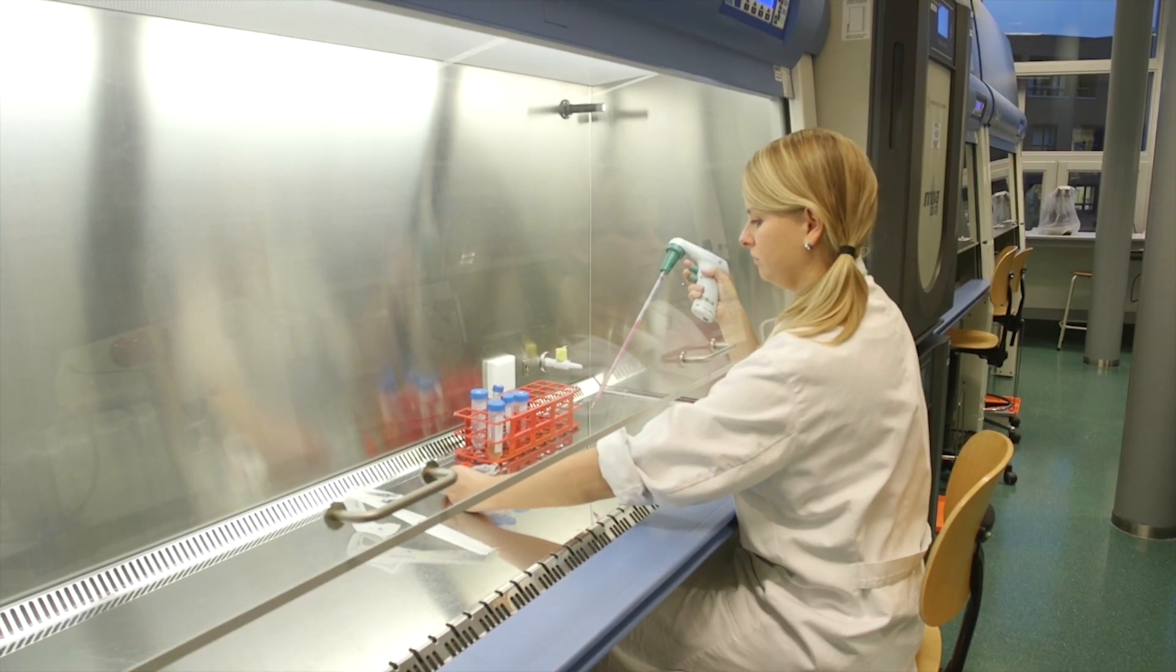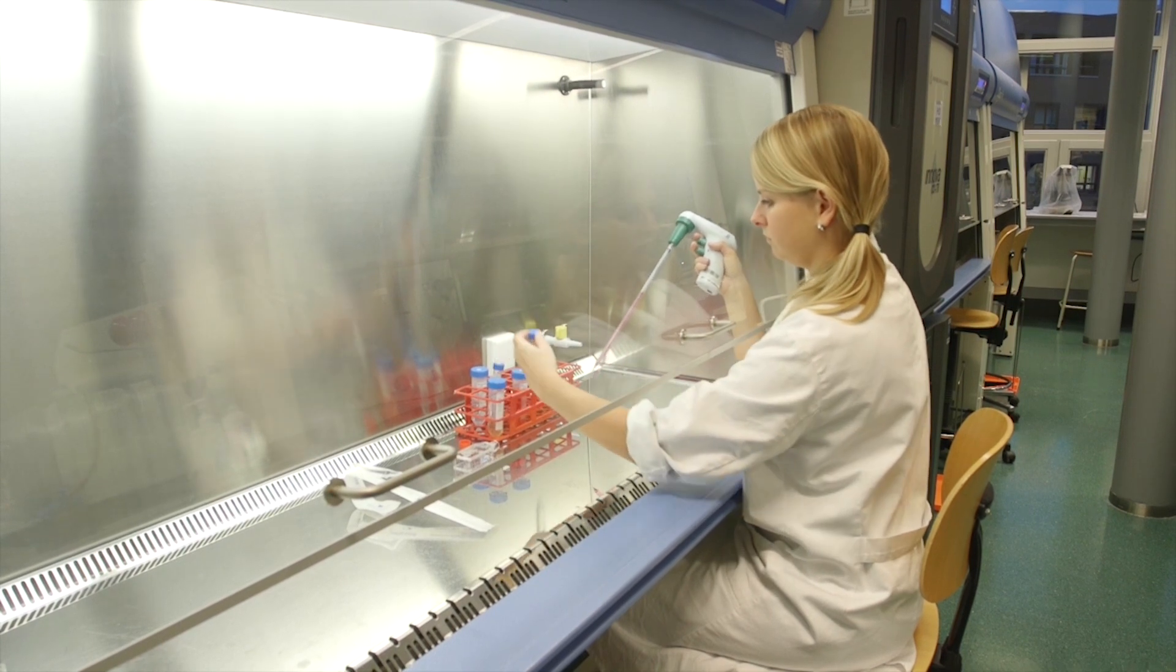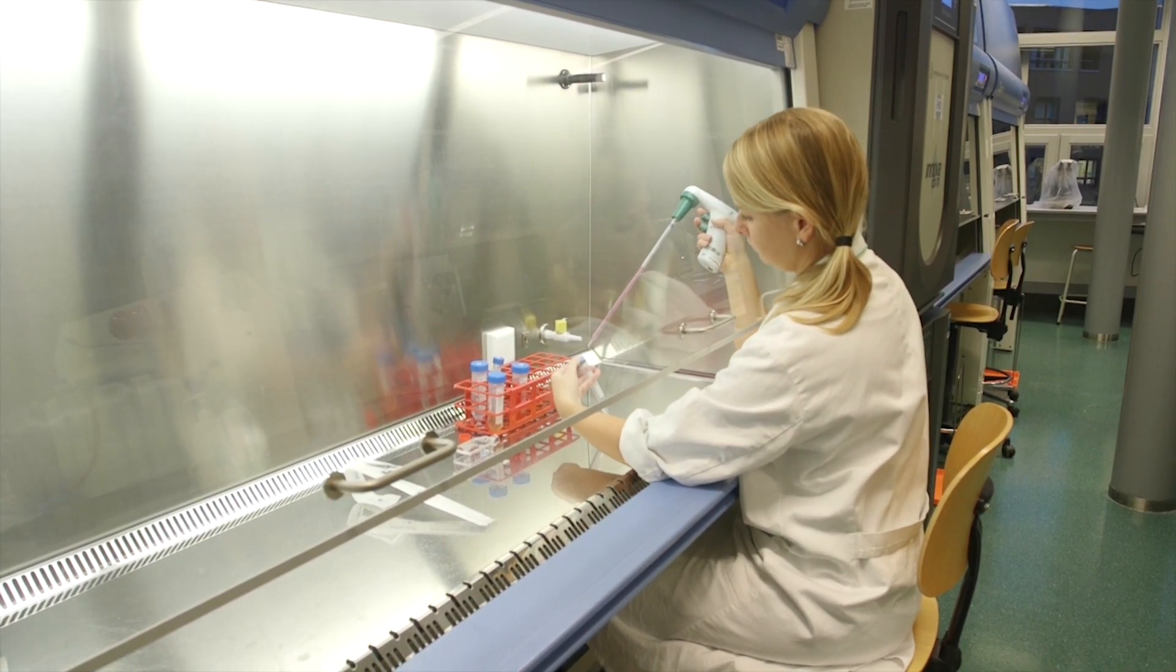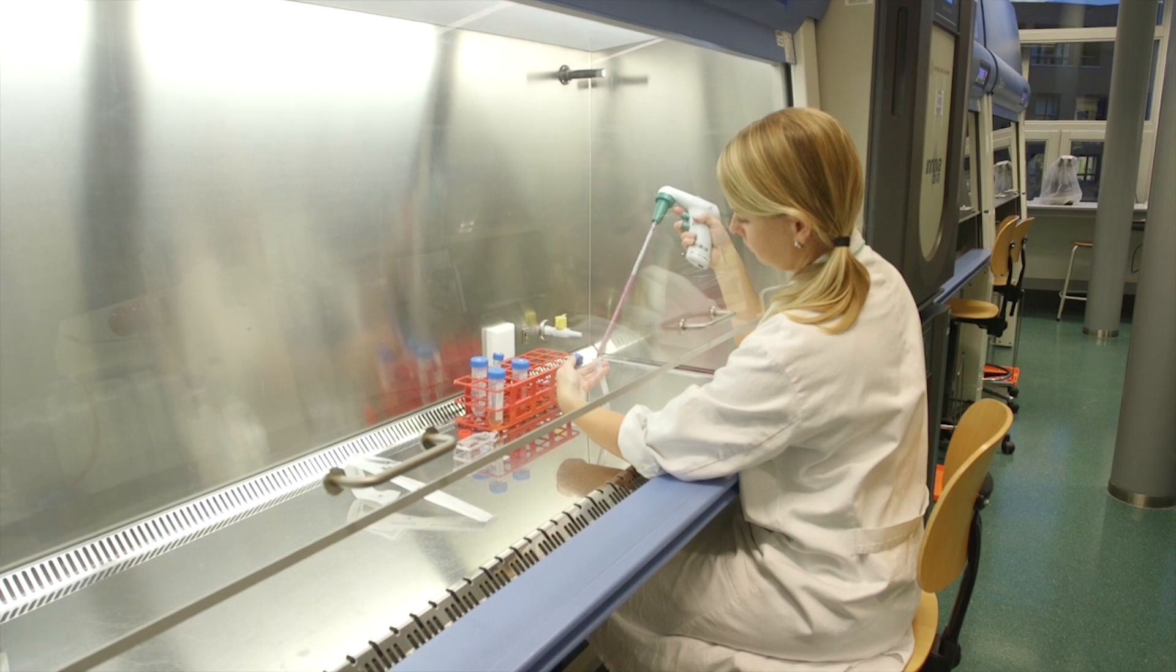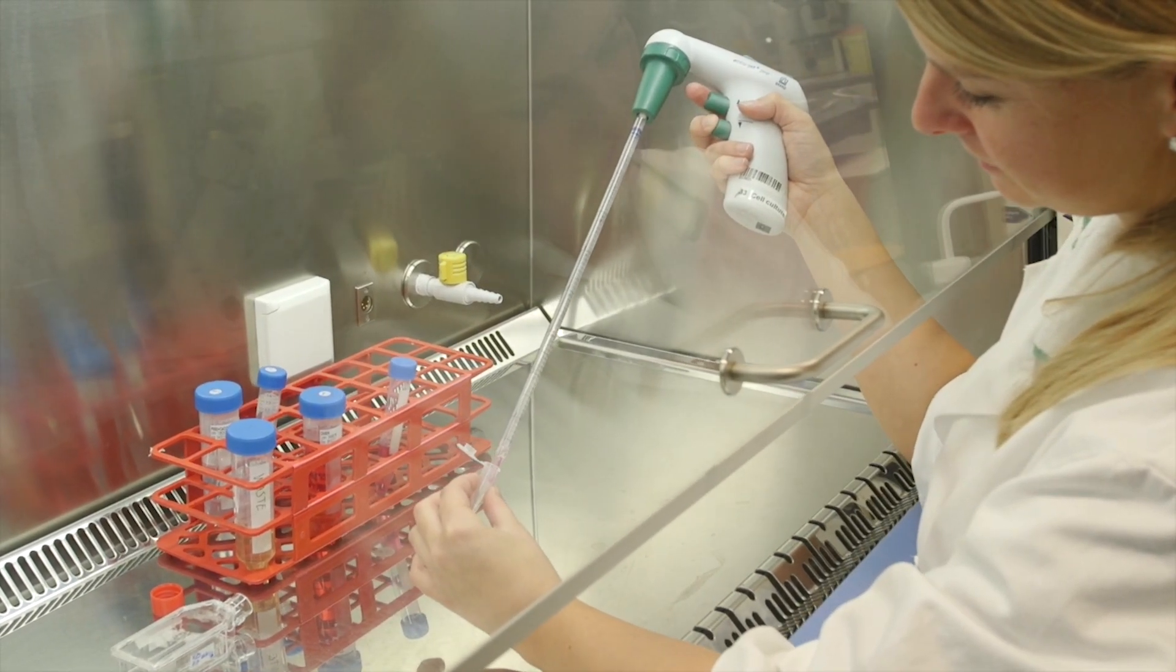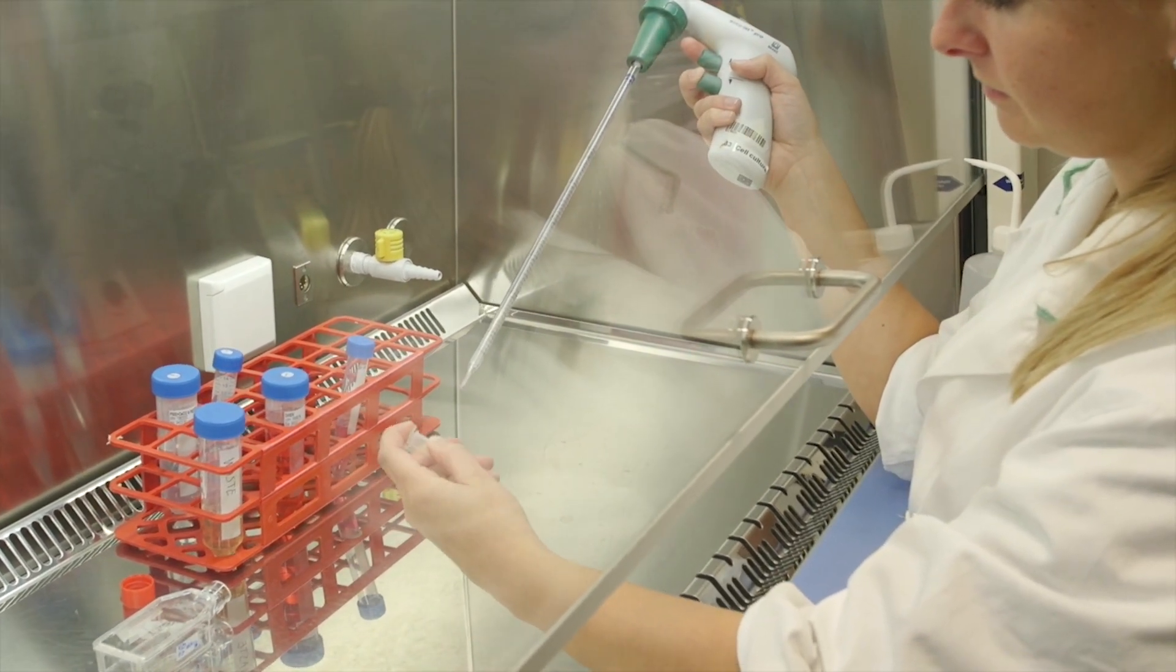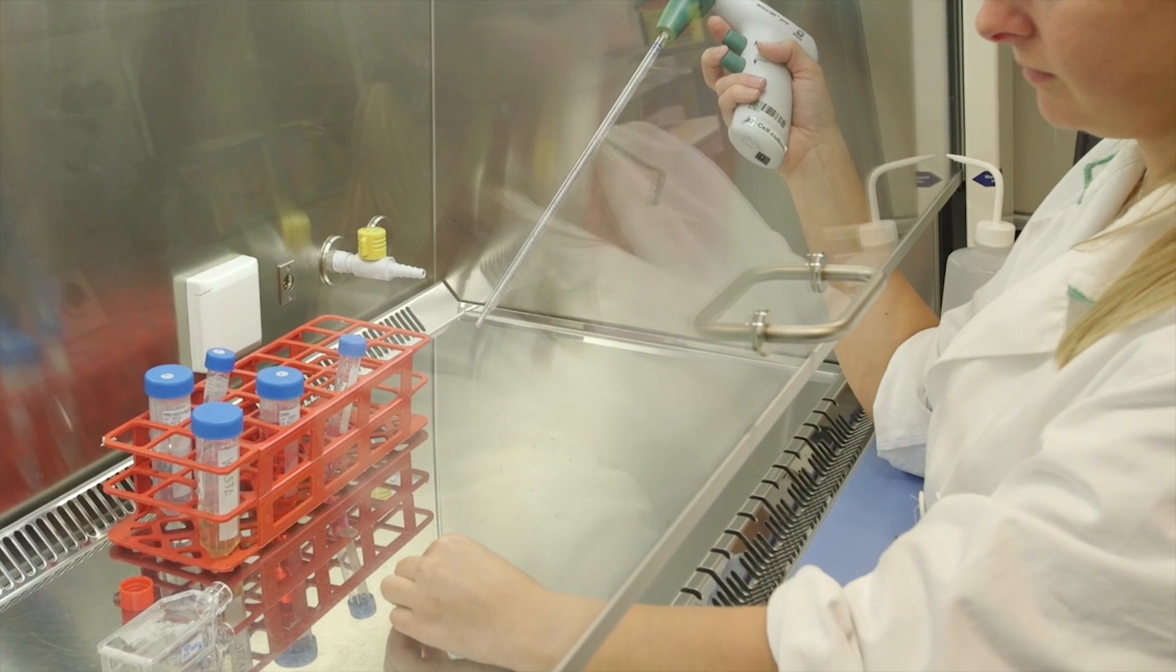When your cells are resuspended, transfer them temporarily to a 15 ml falcon tube. This is to prevent the cells from attaching to the culture flask again before you have passaged them. A small volume of the cell suspension is transferred to a non-sterile eppendorf tube. This eppendorf is taken out of the flow cabinet to determine the concentration of the cell suspension.